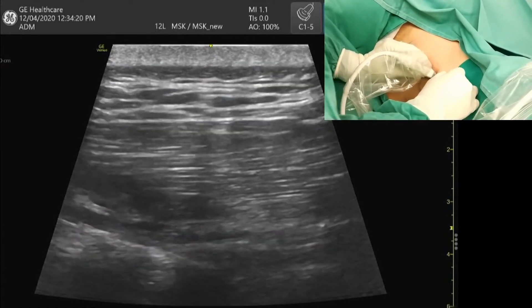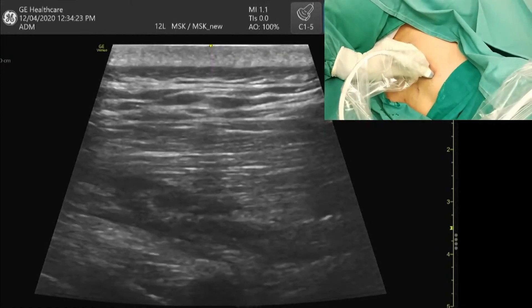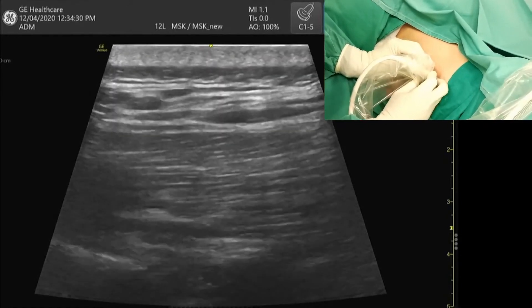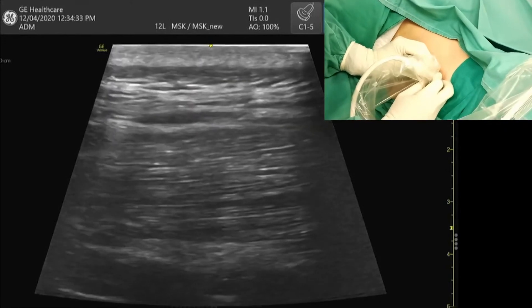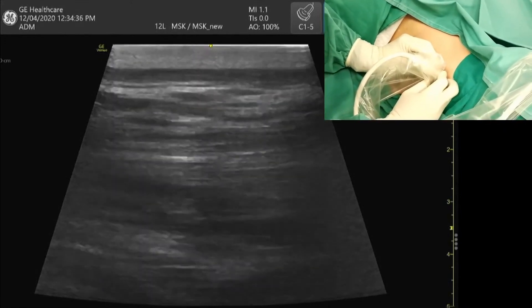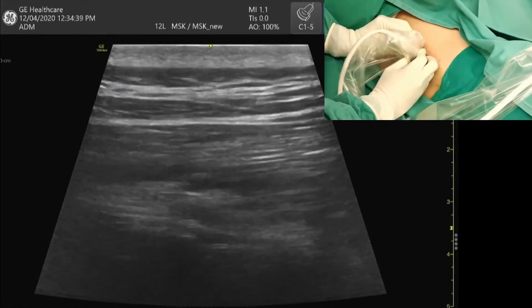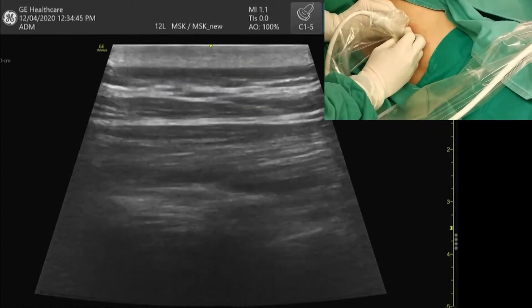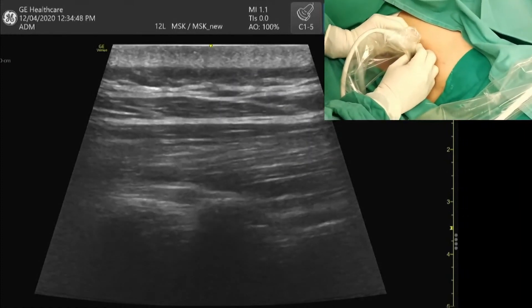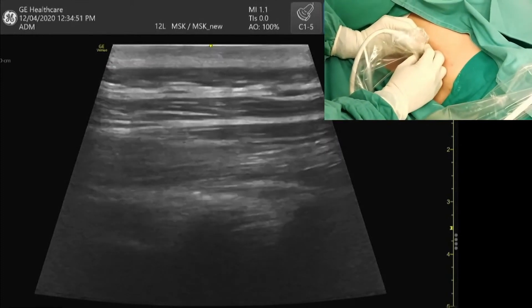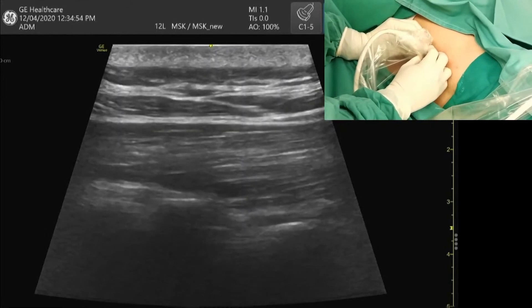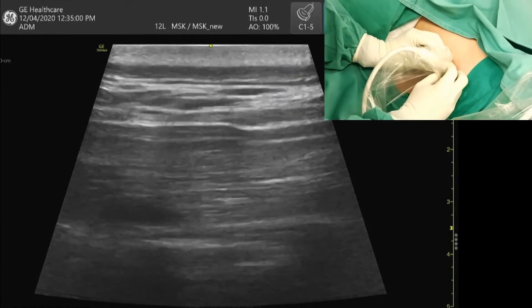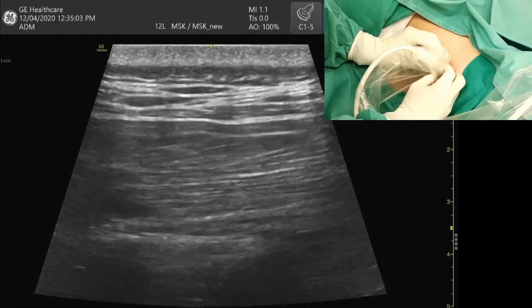Now I'm going to withdraw my needle and scan again to confirm that the local anesthetic has spread a few transverse process levels lower. There should be cephalad and caudad spread of the local anesthetic. If the LA is localized at only one transverse process level, it means it is only within the muscle and it is not a successful plane block. If the LA has spread across a few transverse process levels above and below the injection site, that is a sign of a successful plane block.